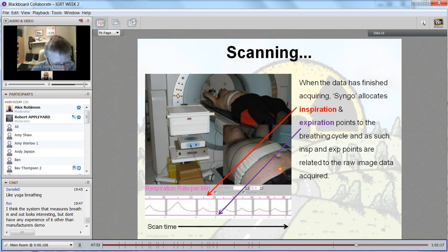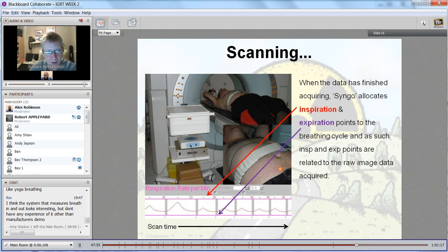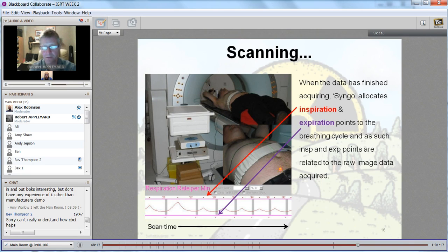Right, there's a couple of people who said that they do use the RPM system, Roz and Carolina here. So you two there, have you come across any issues in its use that have created concerns along the lines of what Alex has said in using the Elekta system?